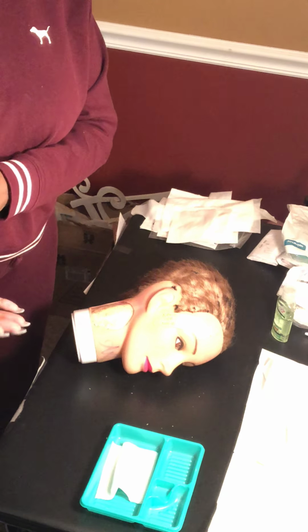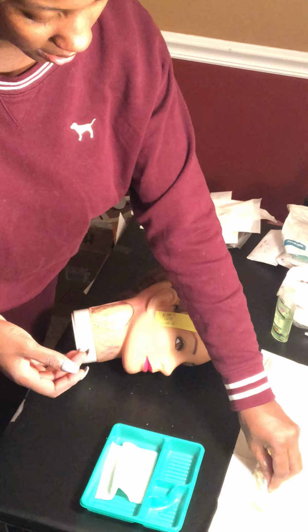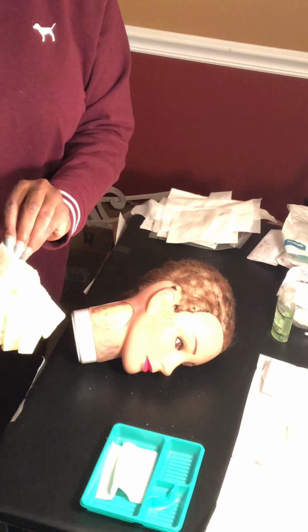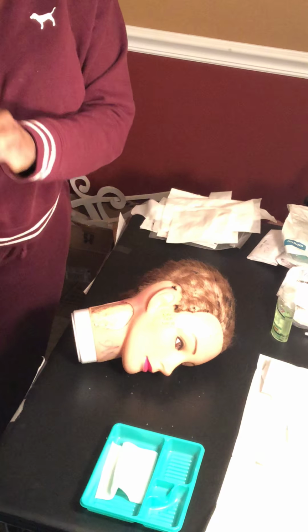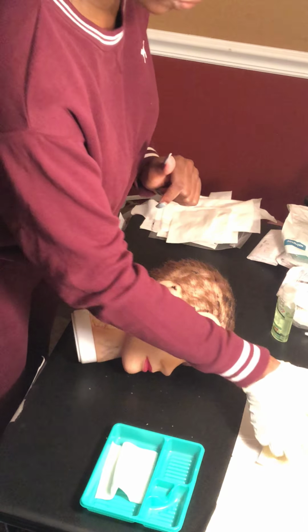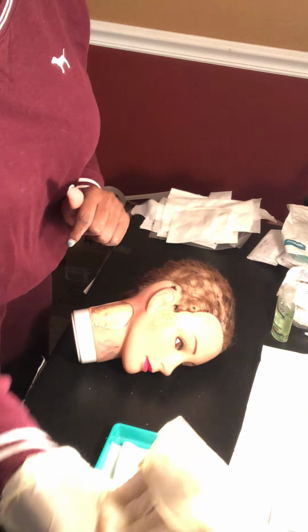And now I'm going to put on my sterile gloves, grabbing the right with the left, and putting my hands in there without touching anything other than this folded part. Got that on. I'm not going to play around with that. Just leave it be. So now I can move these things to the side. Grab my other one, the cuff under.